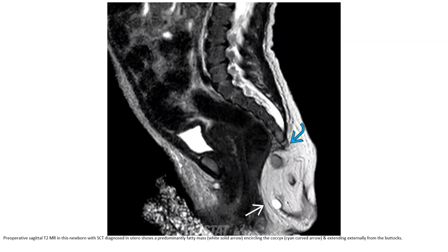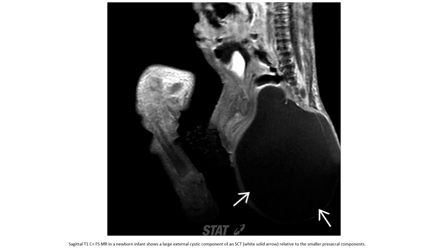This is a T2 MRI in a newborn with sacrococcygeal teratoma diagnosed in utero, showing a predominantly fatty mass with internal calcifications. A T1C+ fat-suppressed image in a newborn infant demonstrates a lipomatous component of the sacrococcygeal teratoma, related to the smaller presacral component.